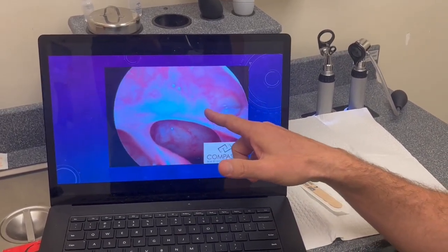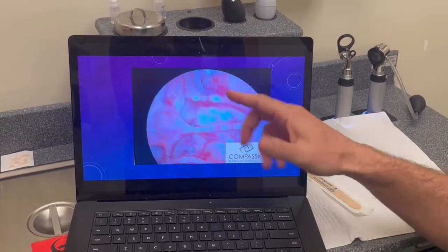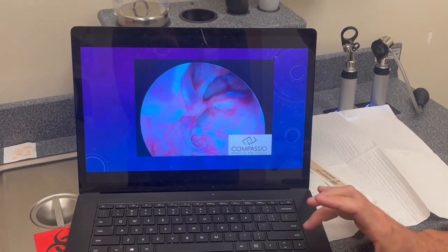Here's a little partition along the skull base, and as we flip the camera upside down, now we're looking up at the skull base. Here's skull base, skull base partition. Here's the lamina or the eye socket, and here's the frontal sinus right up here.